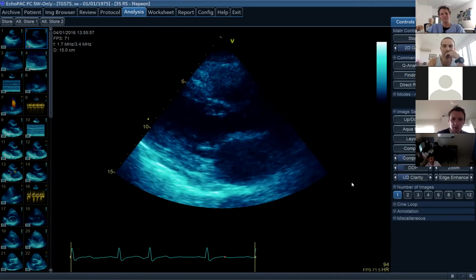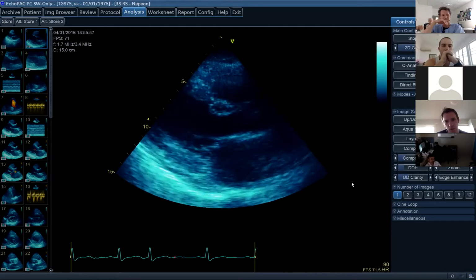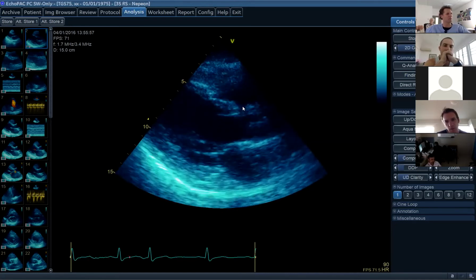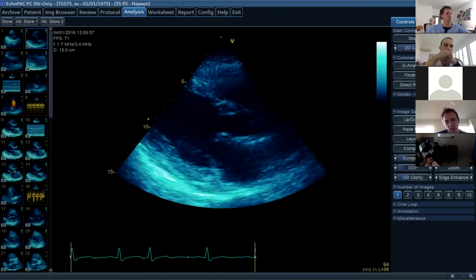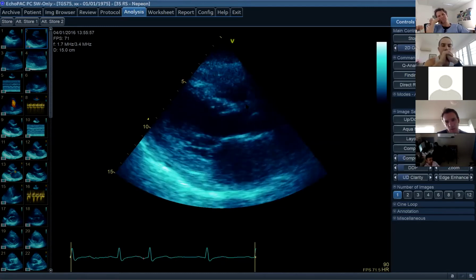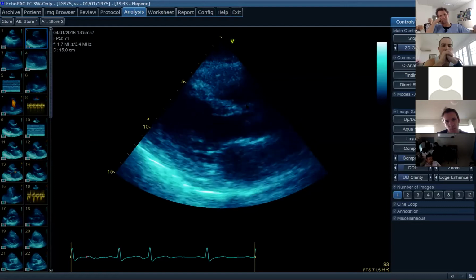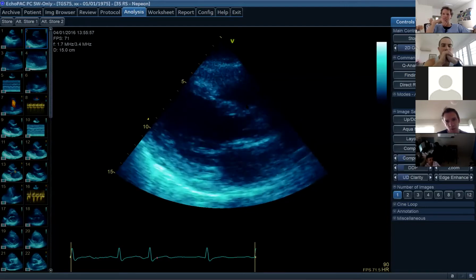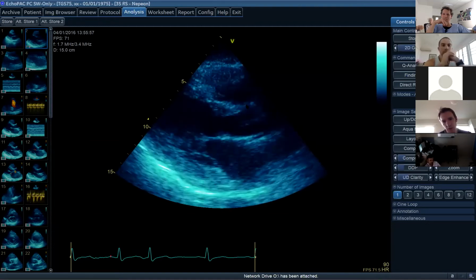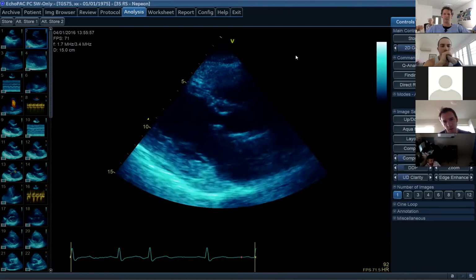All right, so there's a parasternal long axis view. The LV appears potentially dilated, but I would like to measure it. And it is dilated, 56 millimeters. Normal is less than 53, so it's mildly dilated. Then the LV function is clearly reduced on that single view, I'd say moderately reduced, but I would want to see more views. I'm also not sure whether it's optimally cut. I don't see the aortic valve there, to judge regional wall motion abnormalities. At least there's some thickening of the anteroseptal wall and infralateral wall.